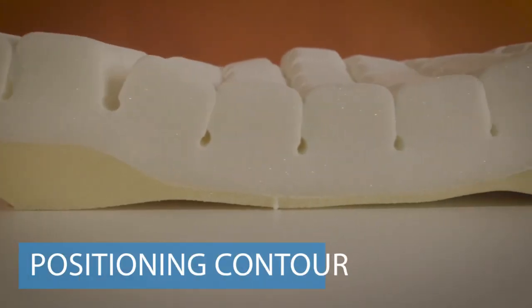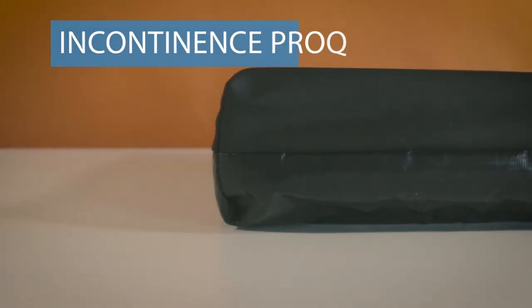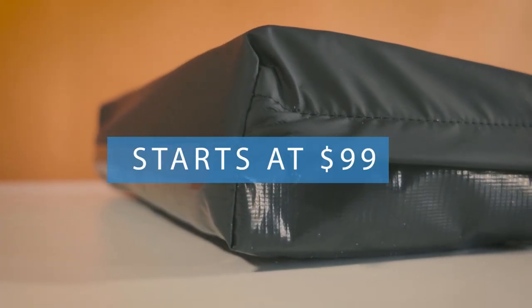The Geo Matte Contour is contoured on top to relieve pressure on your legs and encourage an upright posture. An incontinence-proof cover with a super soft, low-shear top wraps up the well-constructed Geo Matte Contour wheelchair cushion, and it doesn't break the bank at just $100.